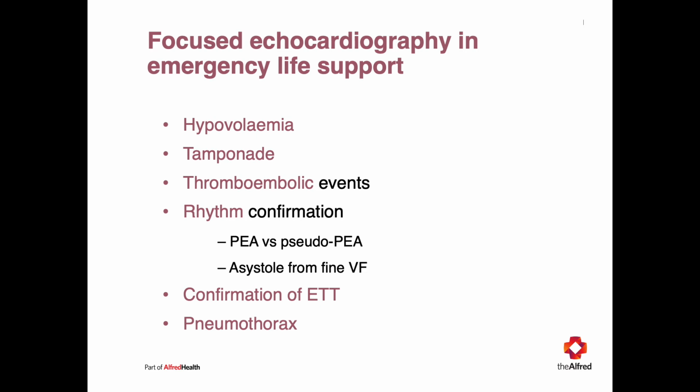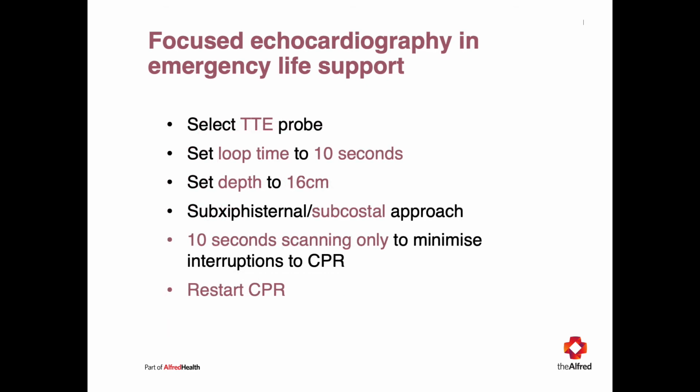Using focused echocardiography in emergency life support, or FEEL, does not have an evidence base but is likely useful in experienced hands. It can be used to look for evidence of hypovolemia, tamponade, pneumothorax, thromboembolic events, and to confirm the cardiac rhythm. It is completed during the pulse check with a time limit of 10 seconds of scanning to minimise interruptions to CPR. In this scenario, the subcostal views are the ones most successfully obtained, and if cardiac structures are not visualised within 3 seconds, the procedure should be abandoned and reattempted during the next rhythm check.